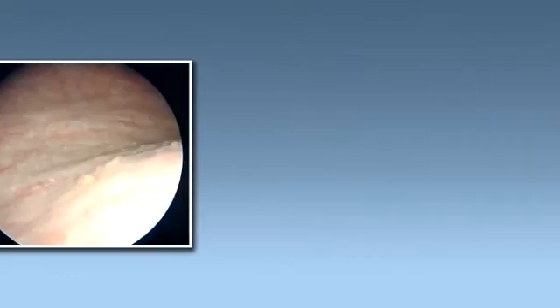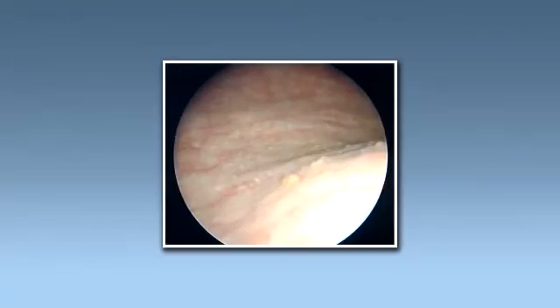These vesicular lesions are commonly observed on the floor of the bladder, including the trigone, and also very anteriorly near the bladder neck area. Women afflicted by this condition have frequent urinary tract infections and no durable response to oral or intravenous antibiotics.